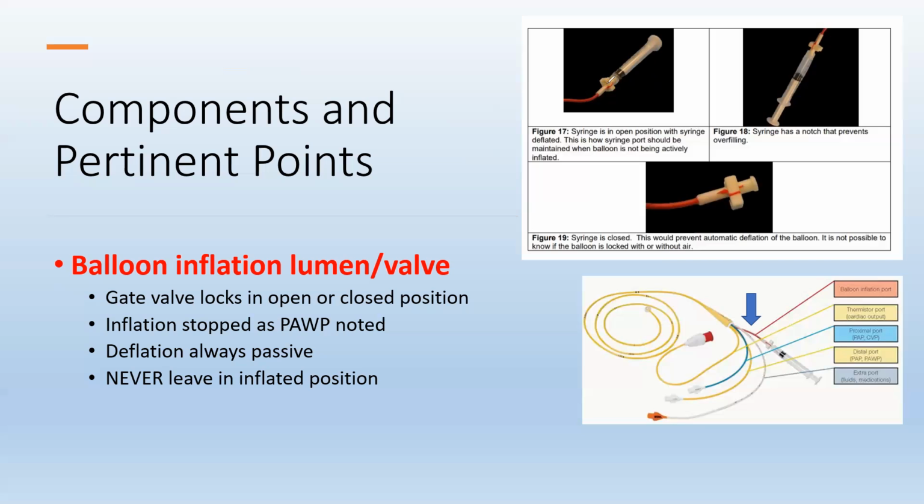When the lines are even, like here, it's going to be open. So it should always be left in the unlocked position, except when you're doing intentional balloon inflation.